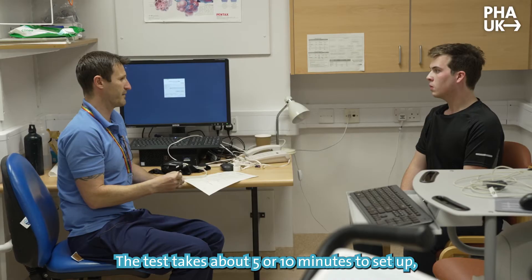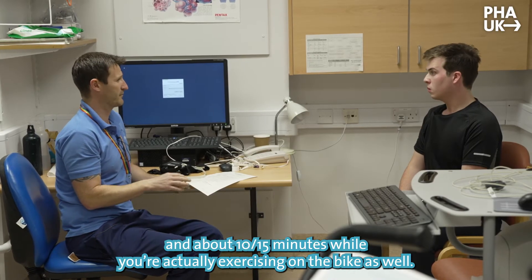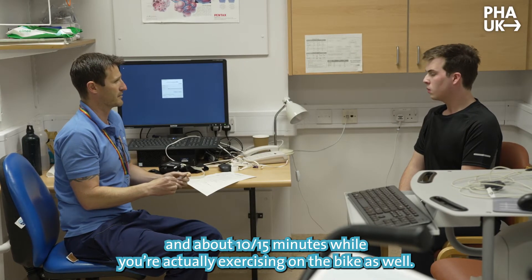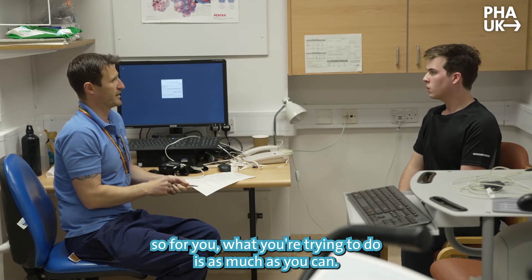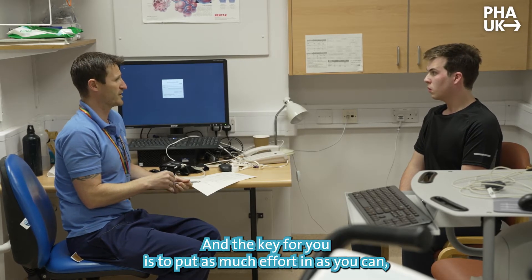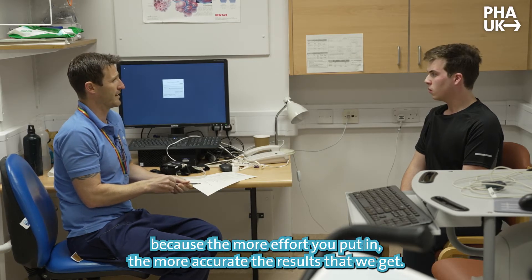The test takes about five or ten minutes to set up and about 10 to 15 minutes while you're actually exercising on the bike. It is a maximal test, so you want to try and do as much as you can. The key is to put as much effort in as possible, because the more effort you put in, the more accurate the results we get.